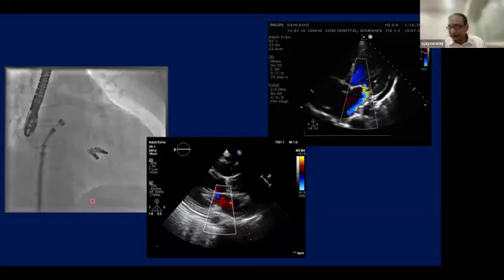It can hit the LA appendage or somewhere else, and then you end up with something you have not really bargained for. And we will use the LA mean as far as possible. If required, you will put a PA catheter also and see what is happening to the PA pressures, because your hemodynamic endpoint has to be very carefully measured.